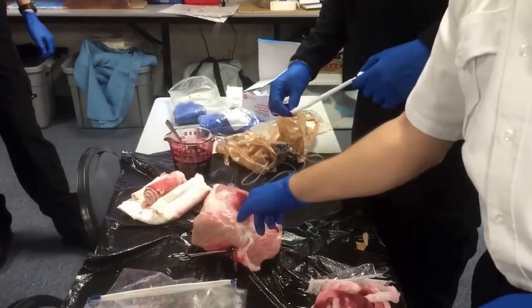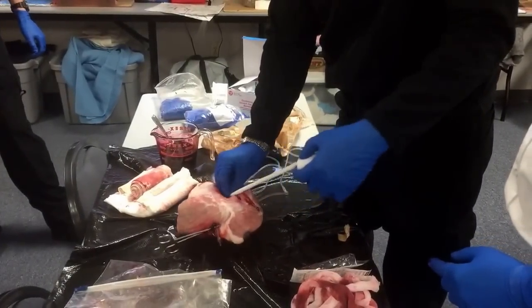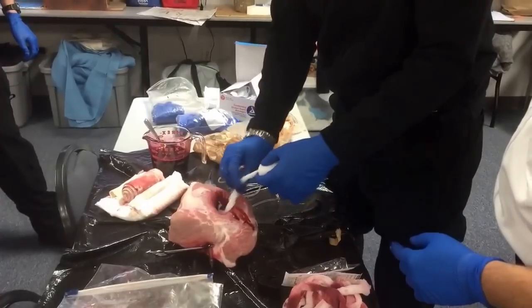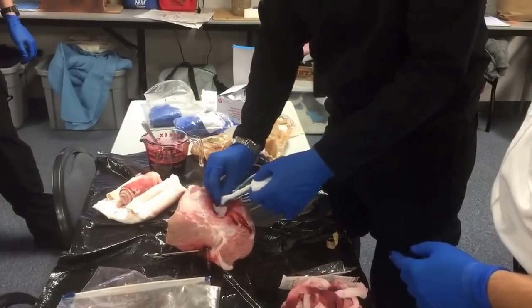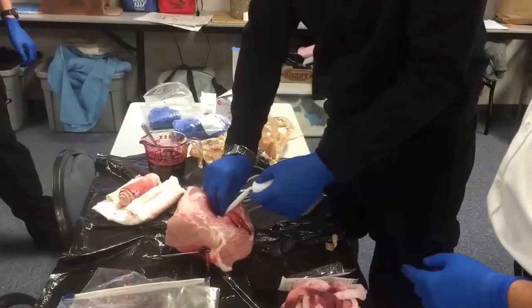First we're going to make sure we visualize the vessel. We found the vessel, we found the bleeder, found the origin. Then we're going to pack the wound directly on top of the injury, right on top of the vessel, as tight as we can.